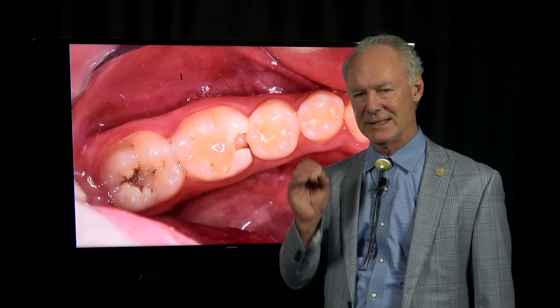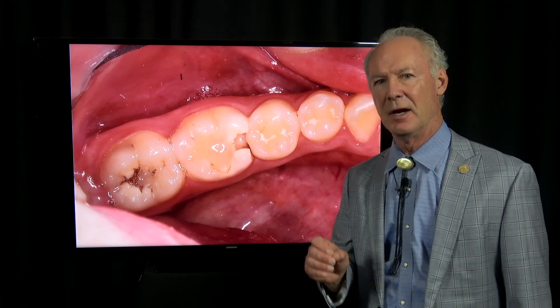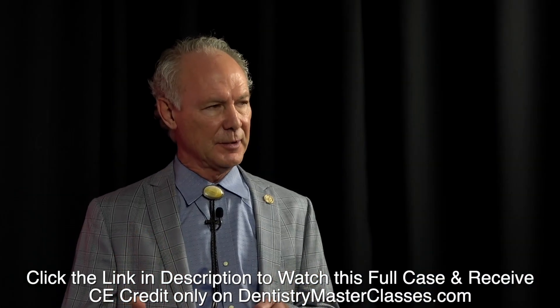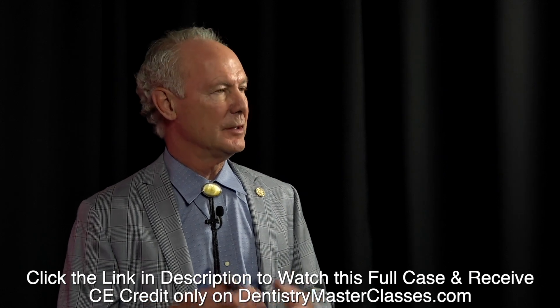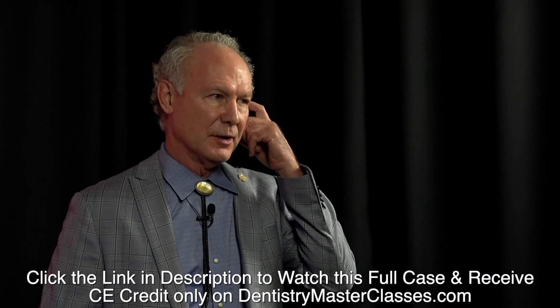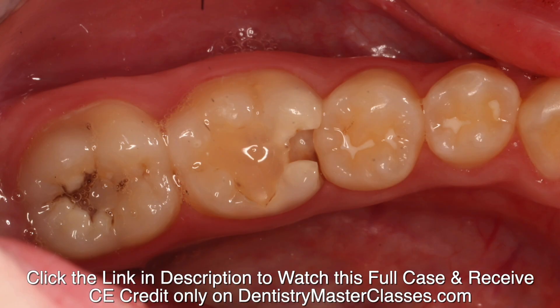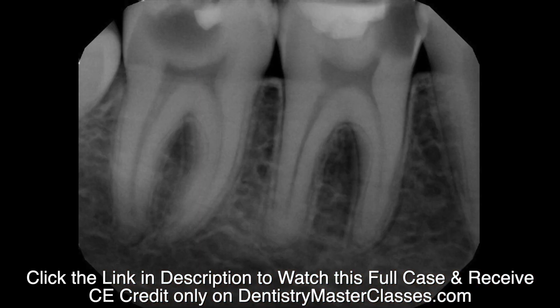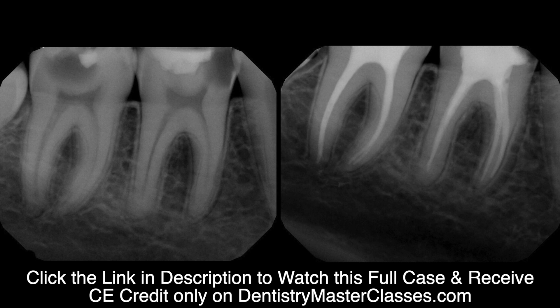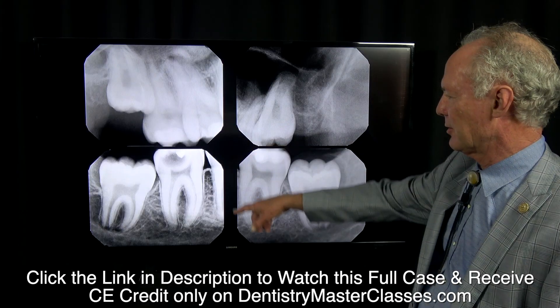This video is on sequencing multiple procedures on the same patient performed at the same appointment. I'm performing these procedures with IV sedation. I'm certified in IV sedation because of a two-year oral surgery fellowship at Baylor Dental College. The procedures I'm going to be doing on this patient are endodontics, lots of decay, crown preparations, and four impacted wisdom teeth extractions.